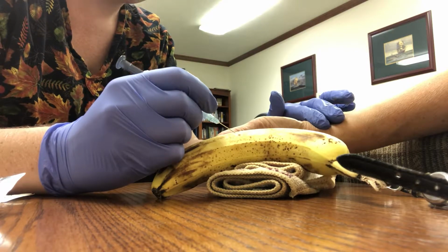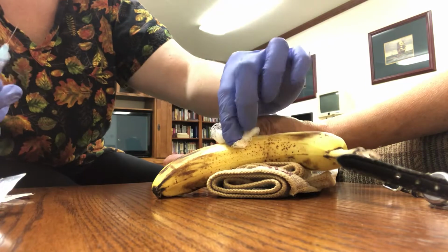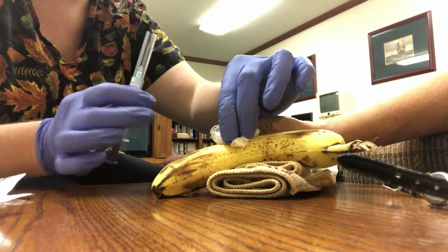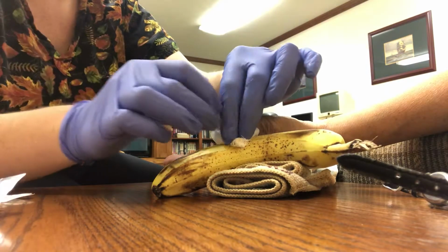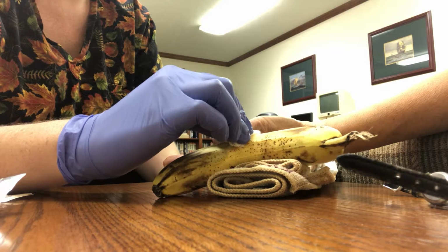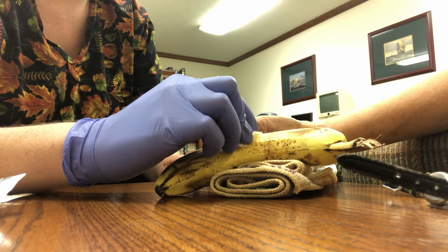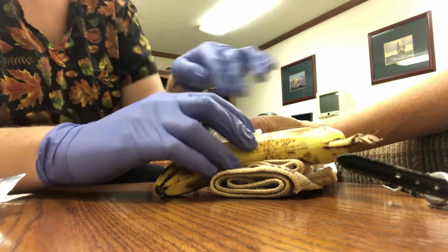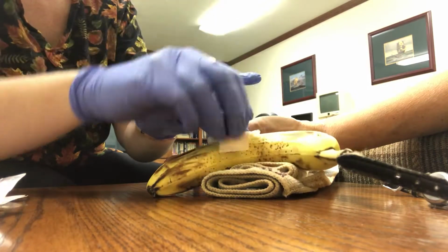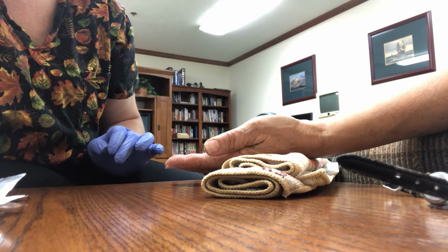That was good. Okay, and then once my needle's full, I'm going to go ahead and apply pressure to the site of puncture, and I'm going to use my safety shield on my needle so nobody gets poked. Okay, and then I'm going to hold that on your wrist for 3 to 5 minutes until the bleeding stops, and I'm going to be looking for swelling, redness, excess bleeding, or any pain that you might have. And then once our bleeding stopped after that 3 to 5 minutes of pressure, I'm going to go ahead and put a Band-Aid on there. All right, and you're all set to go there, Cheryl.